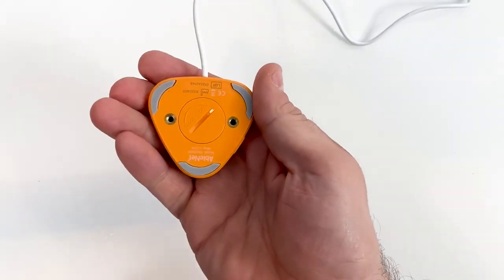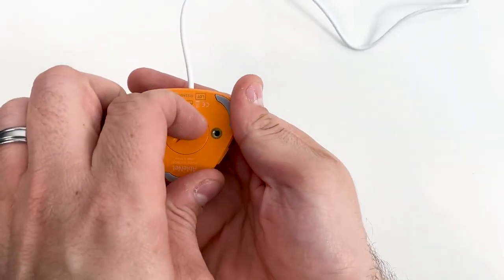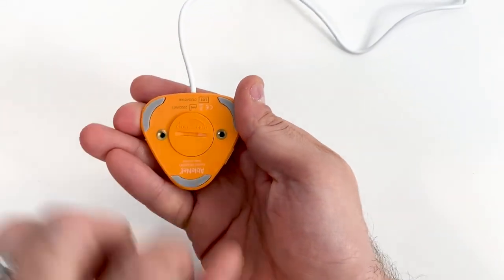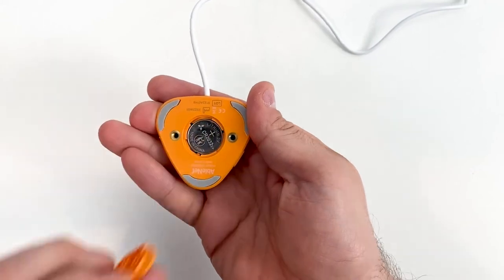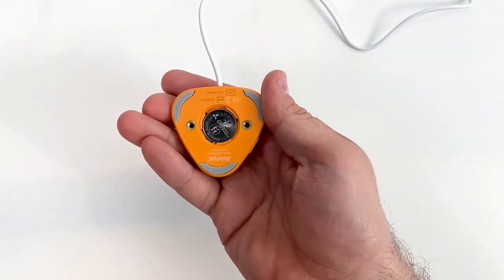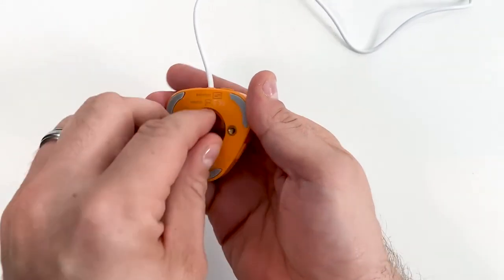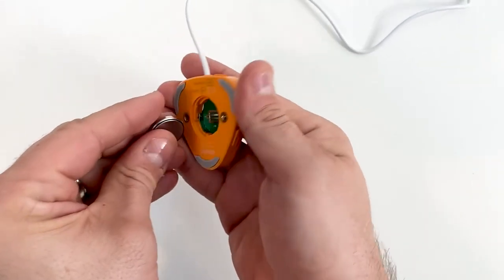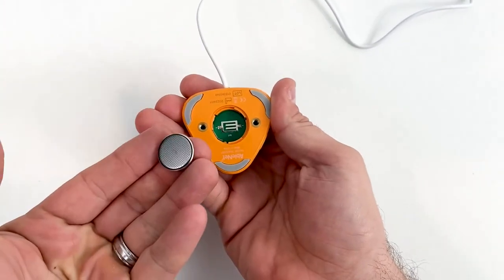On the back of the device, turn the battery cover clockwise to unlock the battery cover. Remove the battery cover, then gently pull the battery to release it.